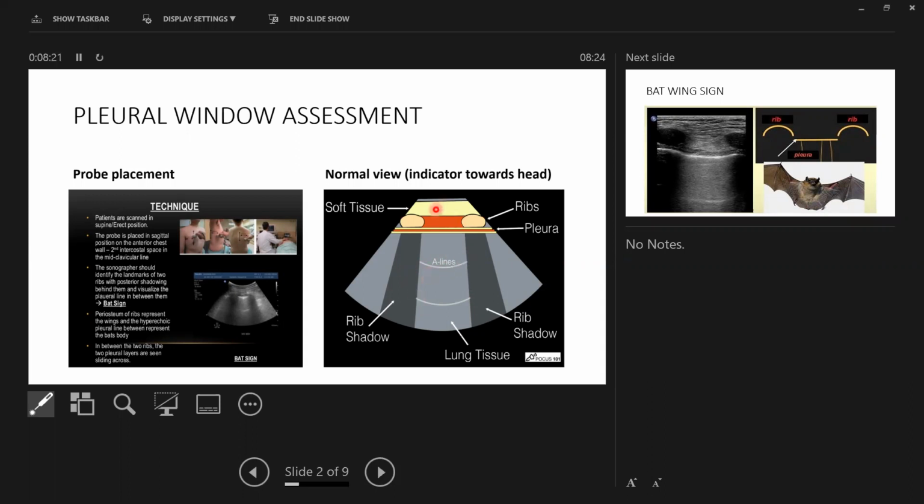If you remember back to the first lecture, we said that when ultrasound beams hit something, ultrasound is waiting for those beams to bounce and go back. So bone bounces back everything. Everything that hits this bone goes back to the probe. That's why you don't see anything beyond that. Anything that's fluid or semi-solid, depending on its density, will bounce back at different speeds and at different times. So that's how it creates an image.